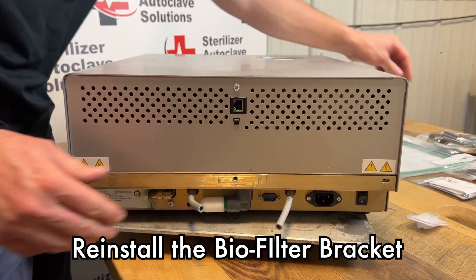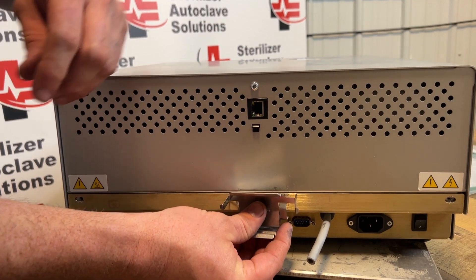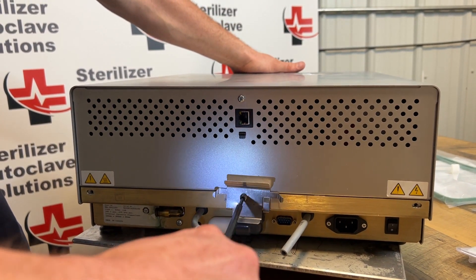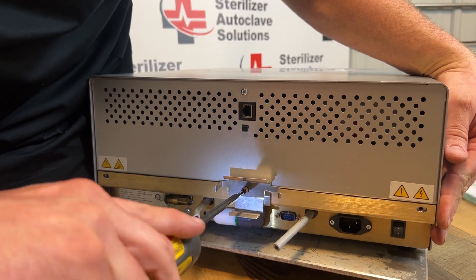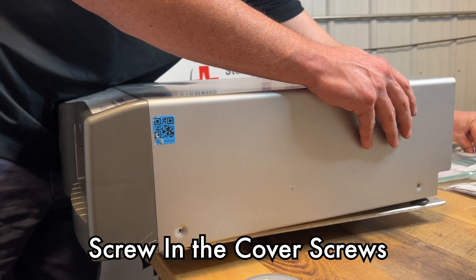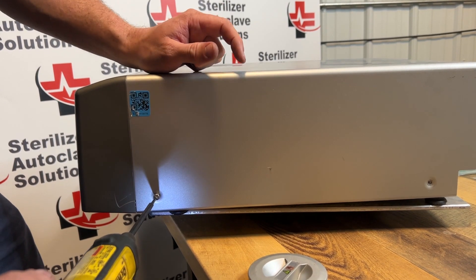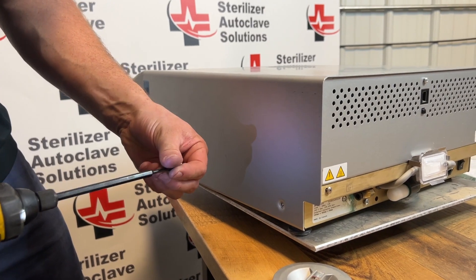On the back we have our biofilter bracket with the single screw. I usually like to start with this middle one because there is no play there. You might have to move the cover to one side. We have four more screws — seven total. Sometimes these will be a little out of adjustment; you might have to push down on the top to get it to seat correctly.